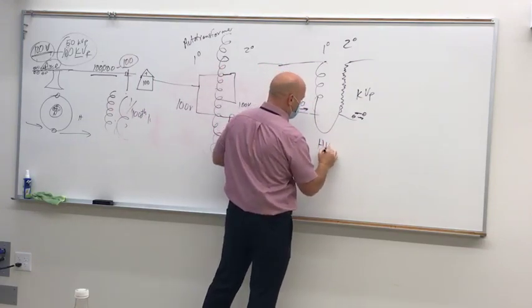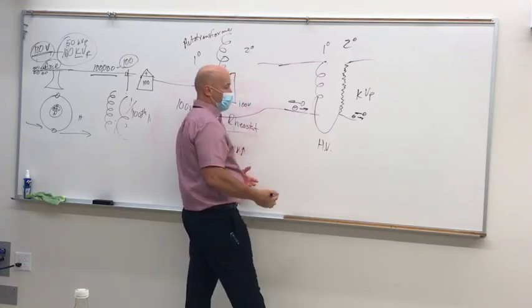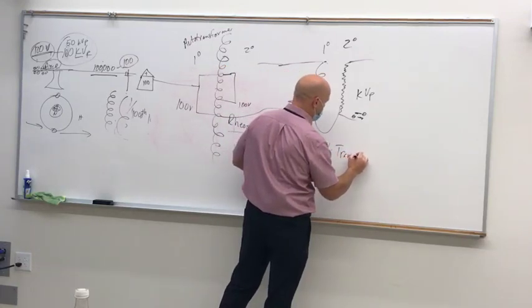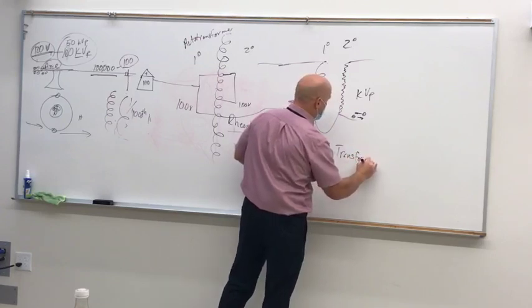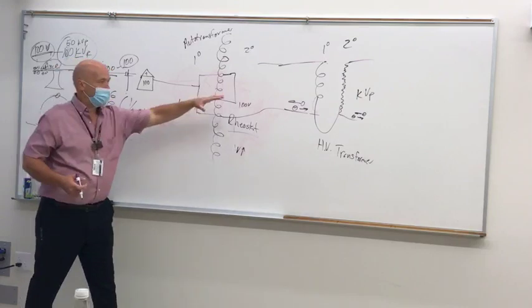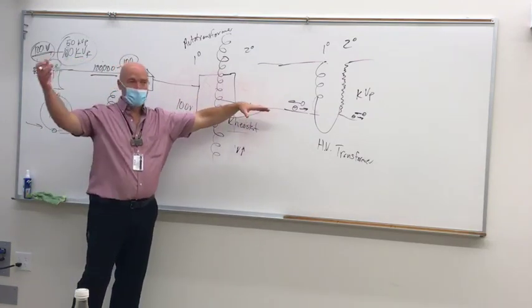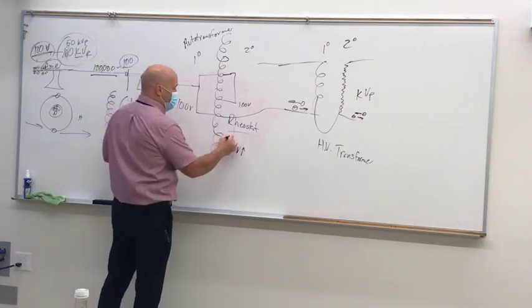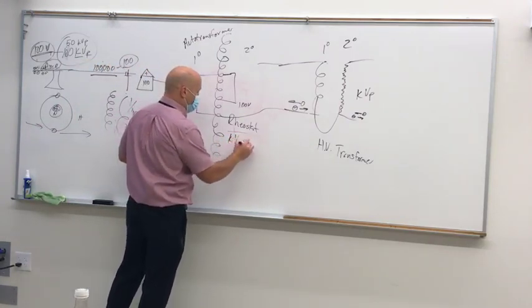This is a high voltage transformer, sometimes referred to as a high tension transformer. Okay, that's the high voltage transformer, and its sole purpose for living is to take what you feed it and boost it from voltage to kilovoltage. So this is also your kVp selector.